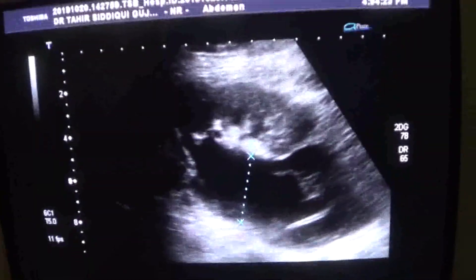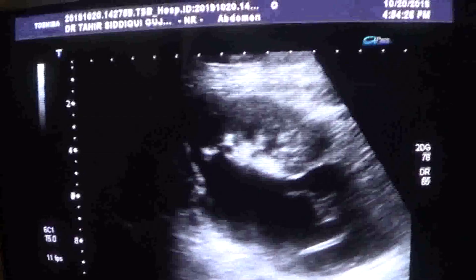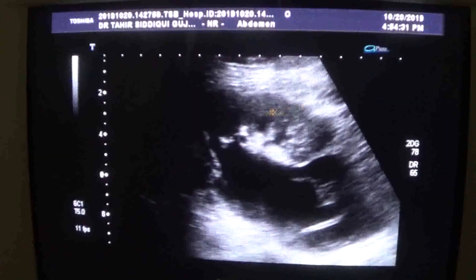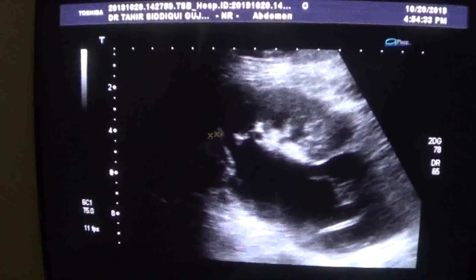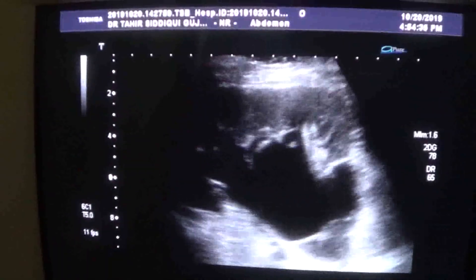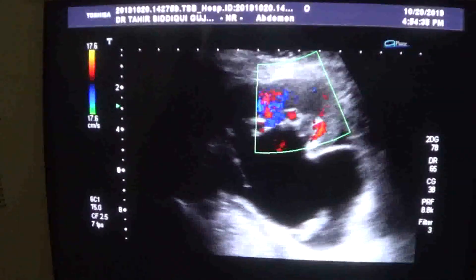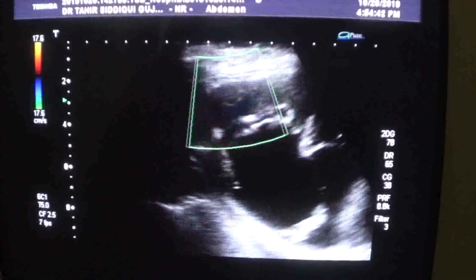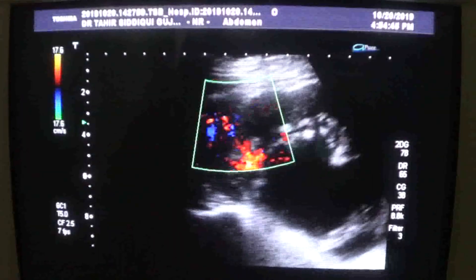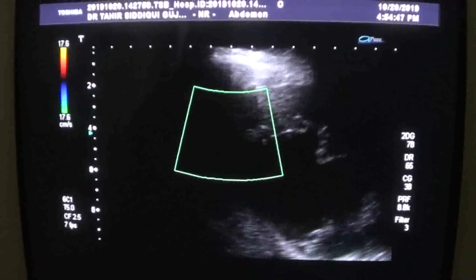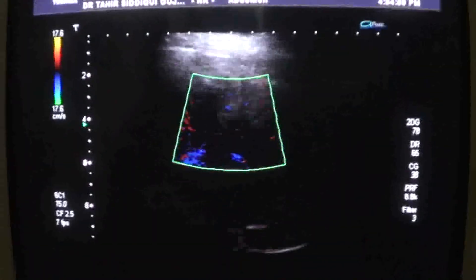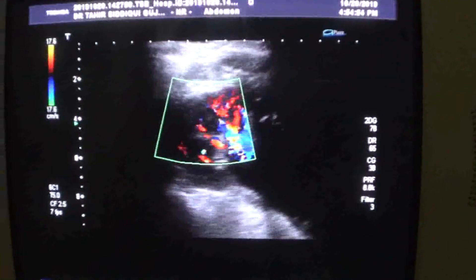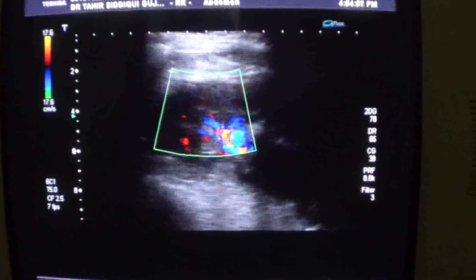Measuring approximately 30.7. The corticomedullary differentiation of the lower pole is also preserved — this is the cortex, this is the medulla. As can be seen by the Doppler study, perfusion of the upper as well as the lower pole is normal, and the RI and SD ratio is also normal.